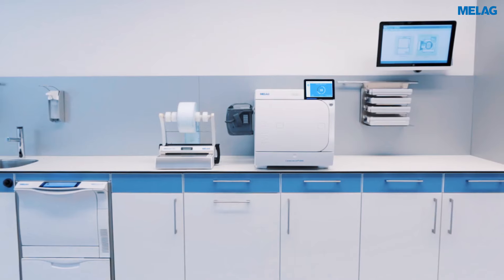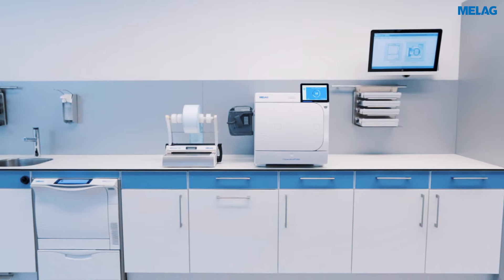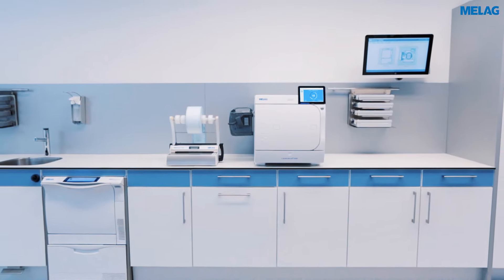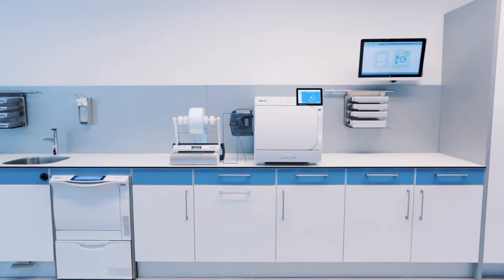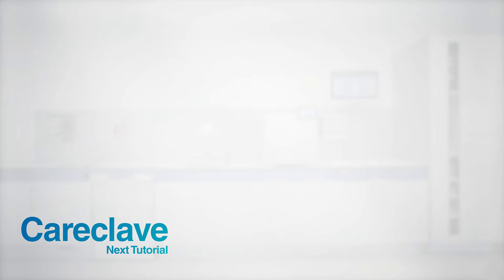After each sterilization program, the intelligent drying system Dry-Telligence optimally adapts the drying process to your load, thus ensuring perfect results. You'll find a detailed overview of the program's specifications in the User Manual and on the Careclave display.